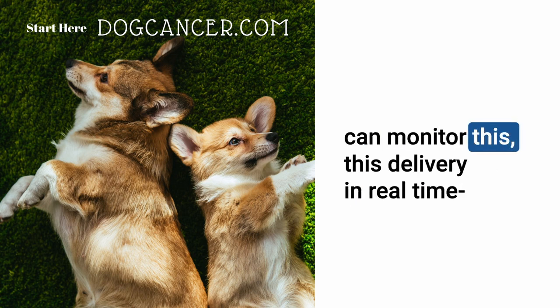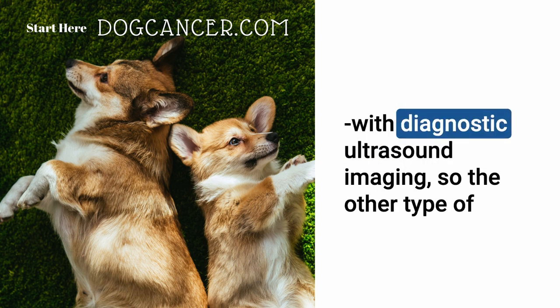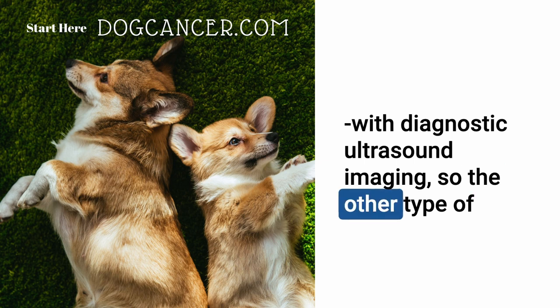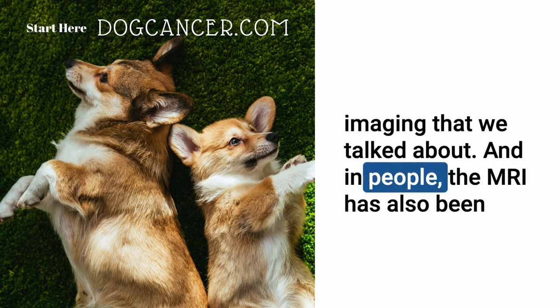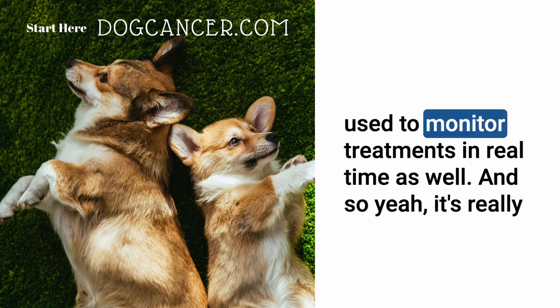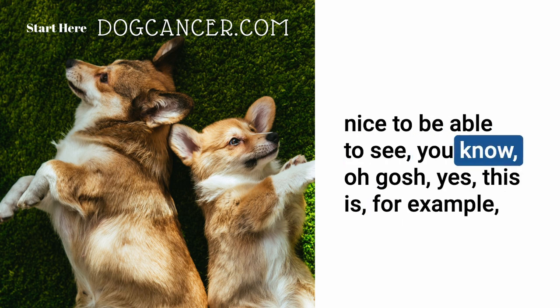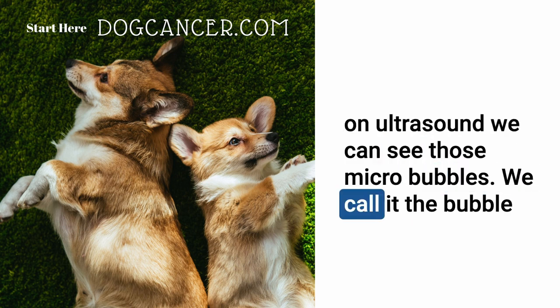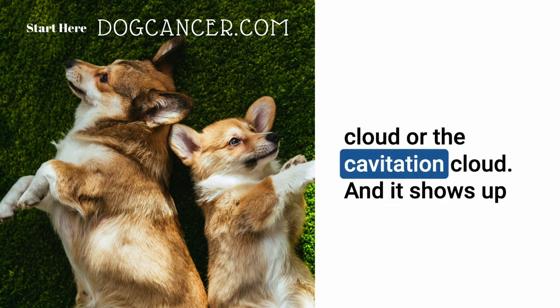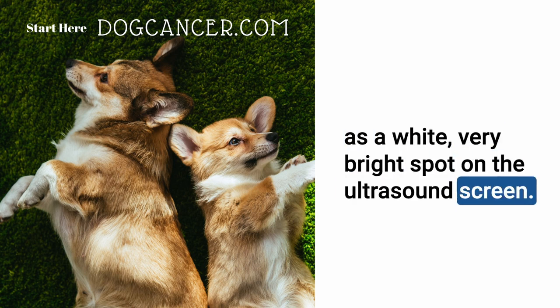We can monitor the delivery in real time with diagnostic ultrasound imaging, and in people MRI has also been used for real-time monitoring. It's really nice to be able to see — on the ultrasound screen, we can see those micro-bubbles. We call it the bubble cloud or cavitation cloud, and it shows up as a very bright white spot on the ultrasound screen.